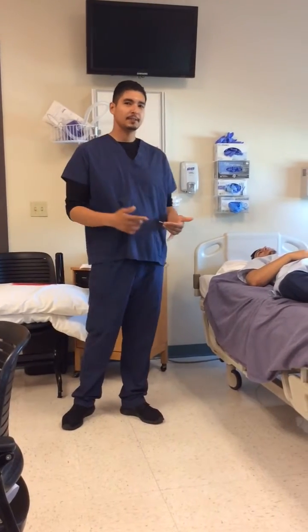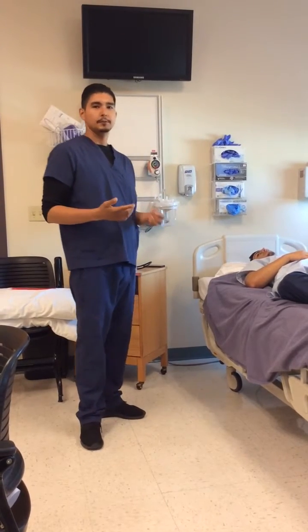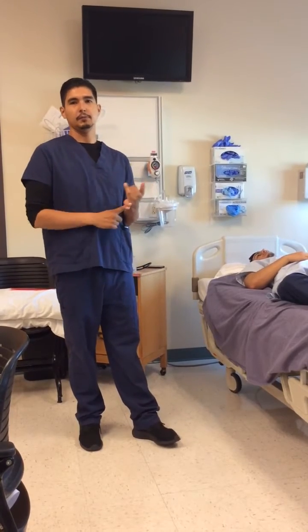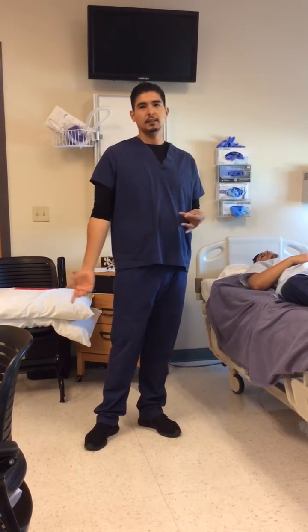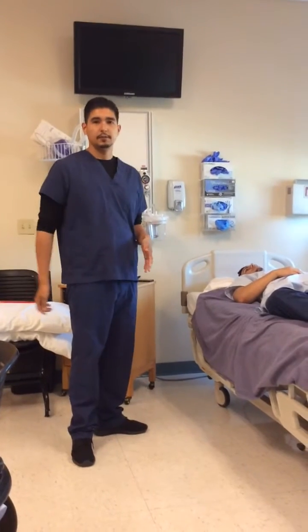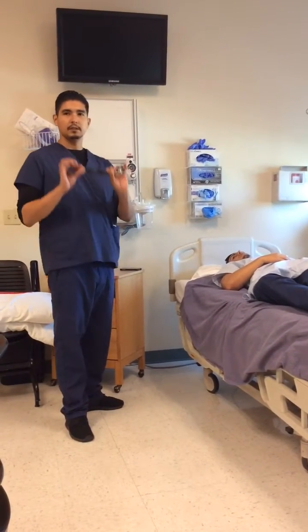So the first thing you want to do is review the patient's chart for any significant findings or any data. So if the patient has any wheezing or crackles or anything that could contradict what we're about to do, such as if the patient is heavily sedated, he might not be able to cooperate for this. You're going to gather your necessary equipment. In my case, you're only really going to need your stethoscope.